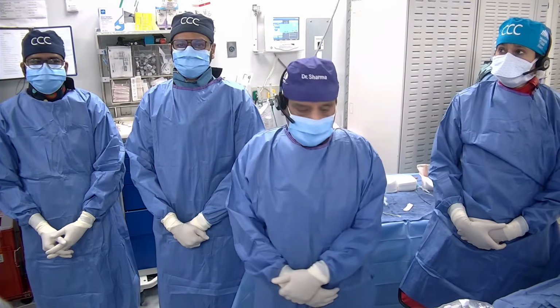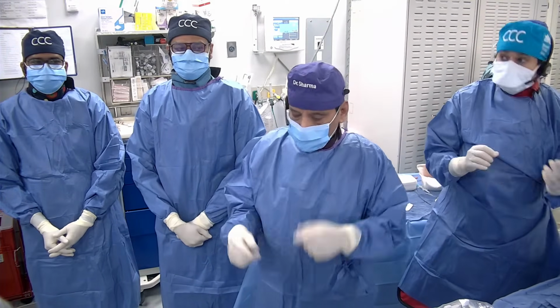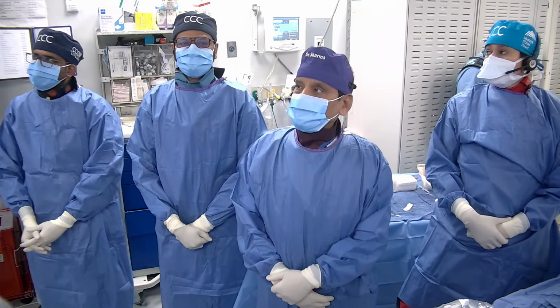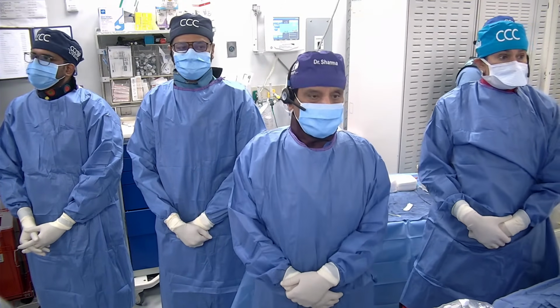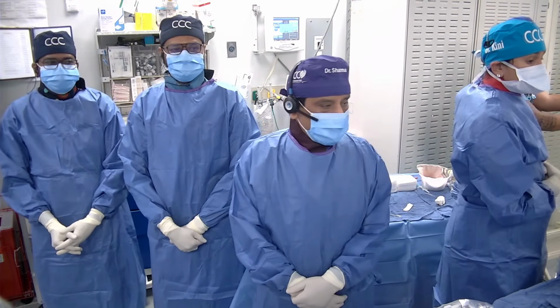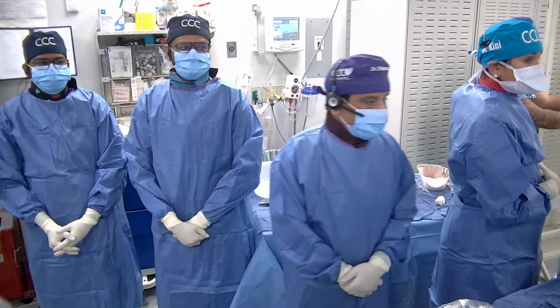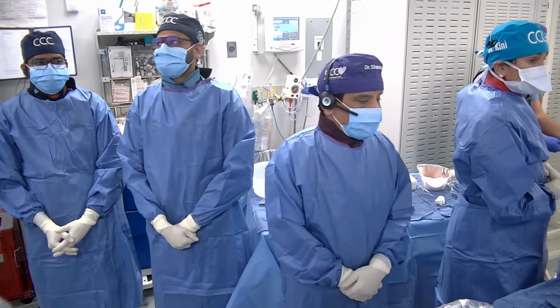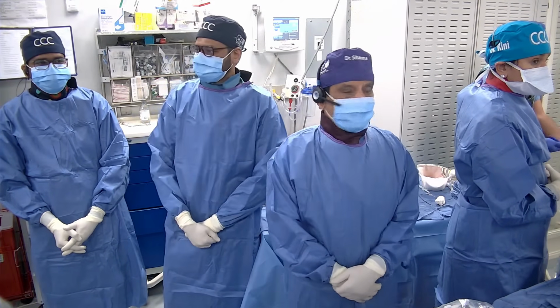I'm sorry for being a little late, but we are ready to show again a bifurcation case. In this one, both branches are very calcified, and with myself and our fellows, Prithvi and Kushal, the rest of the staff is the same: RV and Will as the nurses, CVT Asif and Nera, and imaging is Kiski. So this is the case.